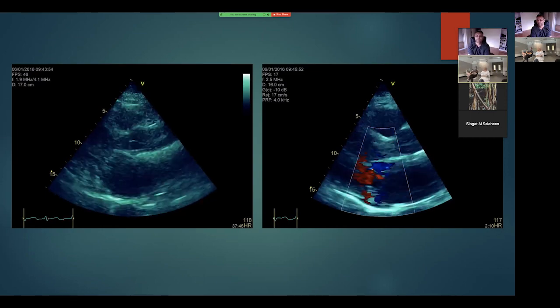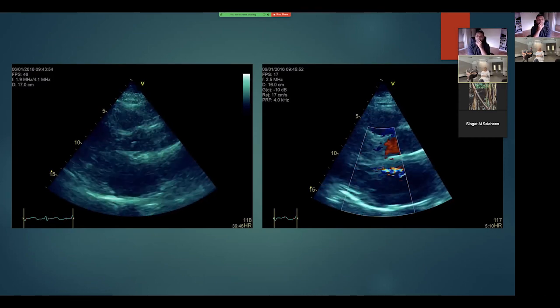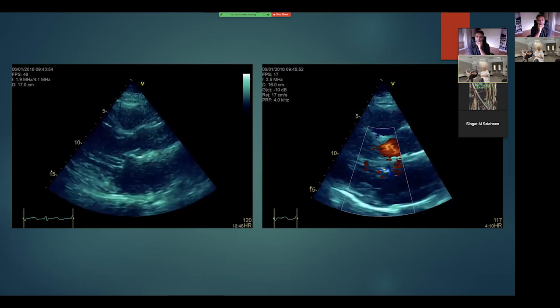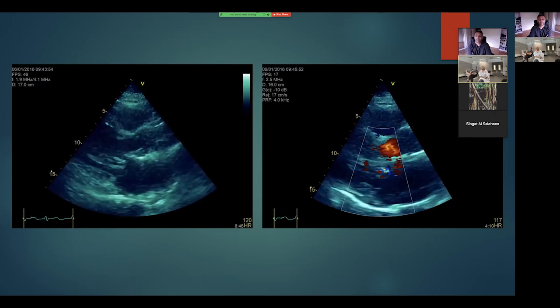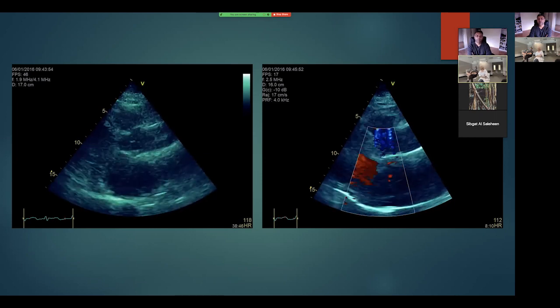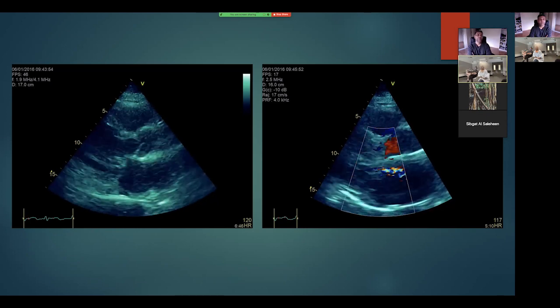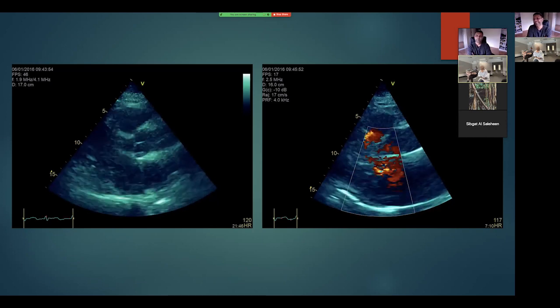The right ventricle looks a reasonable size. The aortic valve is opening well. The left atrium is probably dilated, judging by its relative size compared to the aorta. And the mitral valve leaflets do not look completely normal. Which scallops are we talking about? So we're talking about A2, P2. Thank you. And, obviously this is a talk about mitral valve prolapse, so there probably is prolapse.